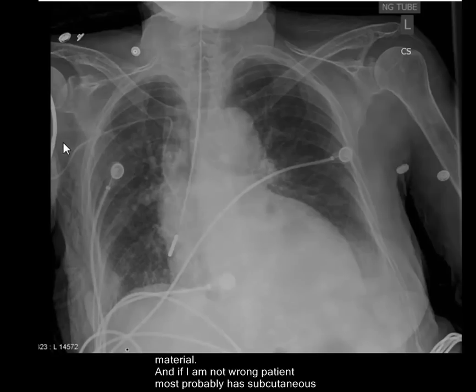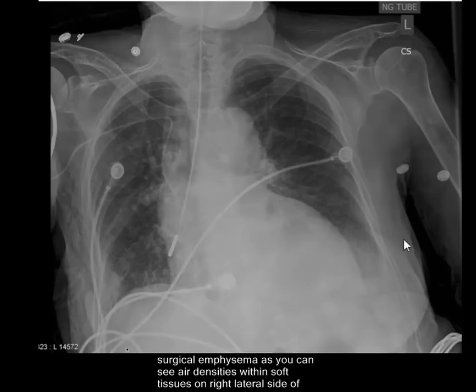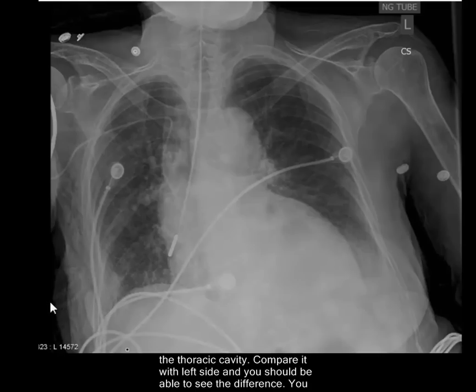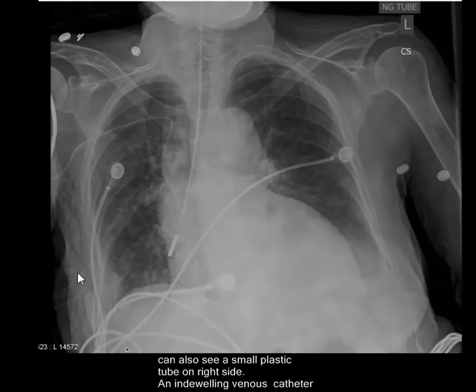The patient also has subcutaneous emphysema, or surgical emphysema. If you compare the left side with the right side of the patient, this is the soft tissue on the left side and this is the soft tissue on the right side — you can see multiple air densities in the soft tissue on the right lateral side of the patient. You can also see a small tube on the right lateral side, probably going into the lung, which may be the cause of the surgical emphysema.